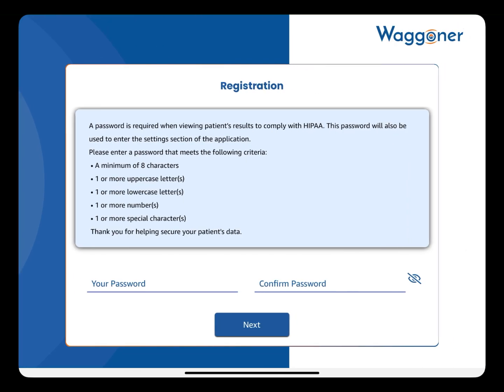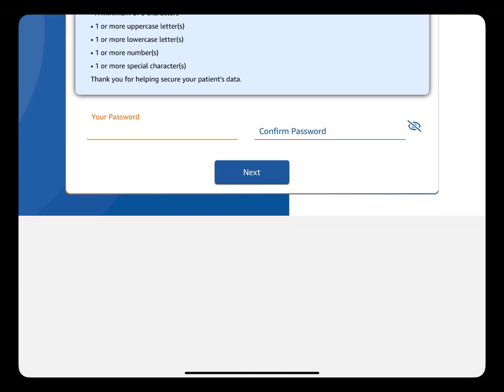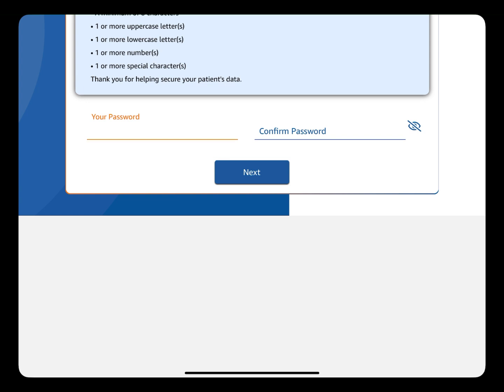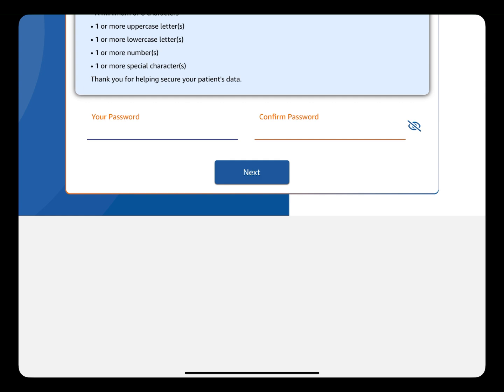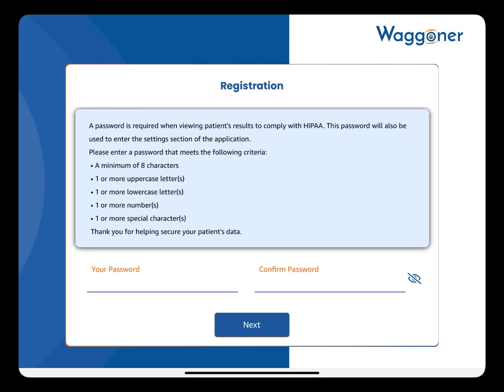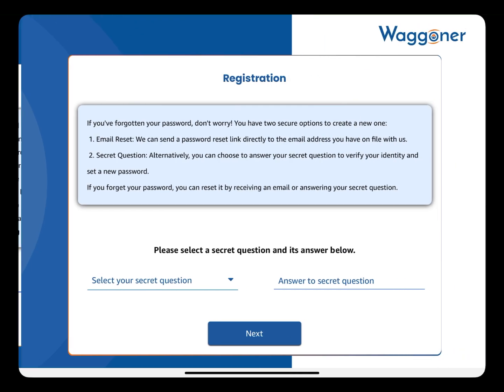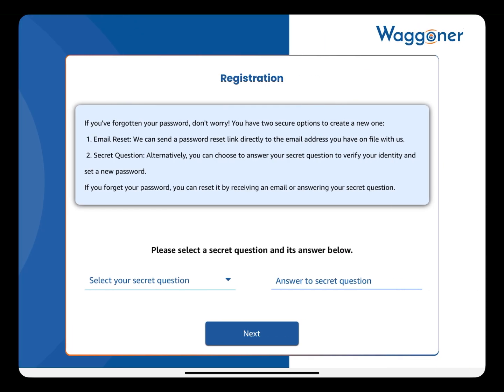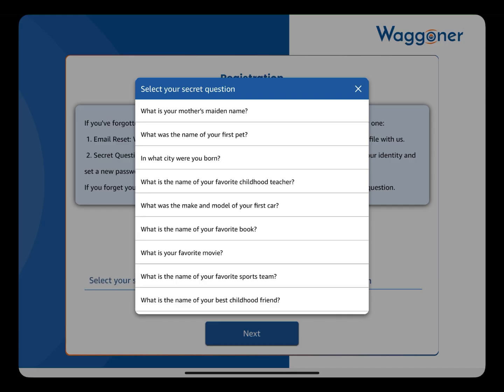Create and confirm a password. Then select a secret question and answer to help restore your account if you get locked out.